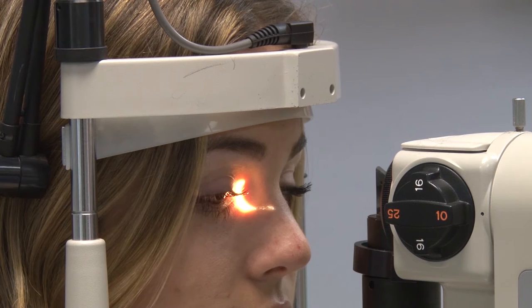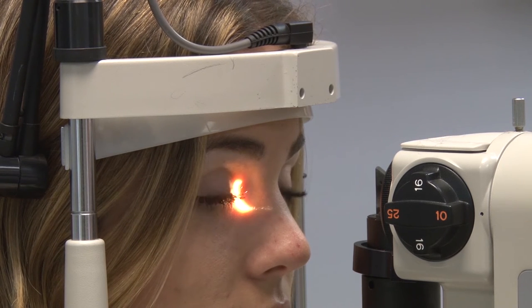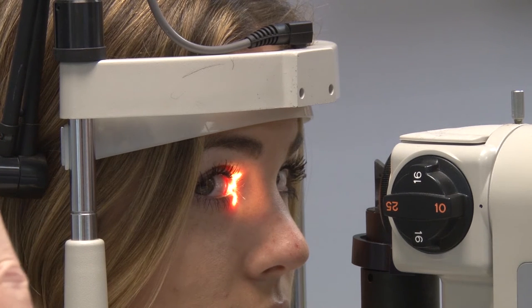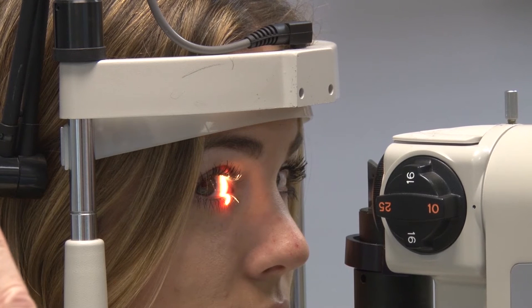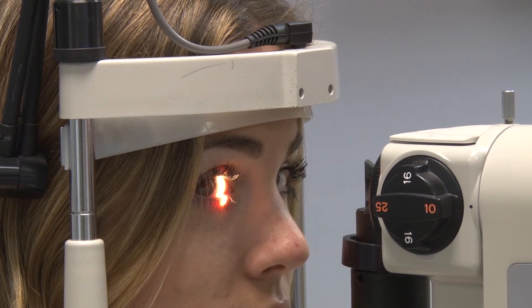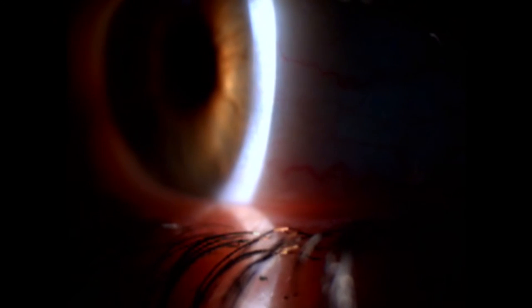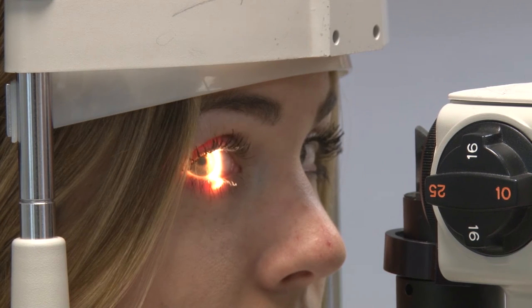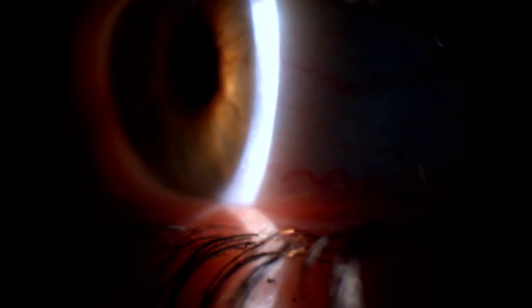The next area is the nasal bulbar conjunctiva. Most of the time I'm not going to have to manipulate her lids — I can simply raise the beam up and ask the patient to look over toward her nose. I'm looking to see how much injection is there; generally it should be pretty white and any blood vessels should be pretty small. In this area near the limbus, I might see things like pinguecula or pterygium at the 3 and 9 o'clock position. As I approach the limbus, I'm looking at the vessels — it's not uncommon for limbal vessels to be a little engorged, but I'm concerned about any vessels penetrating into the cornea.